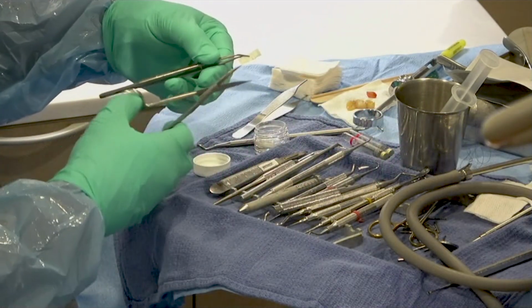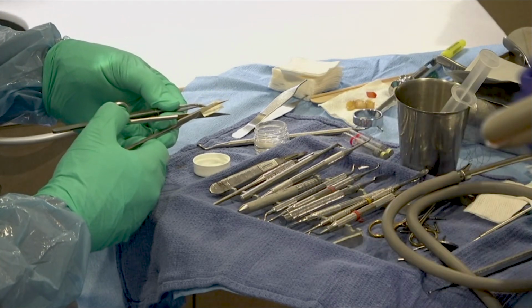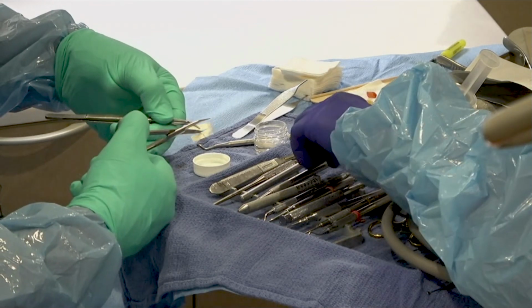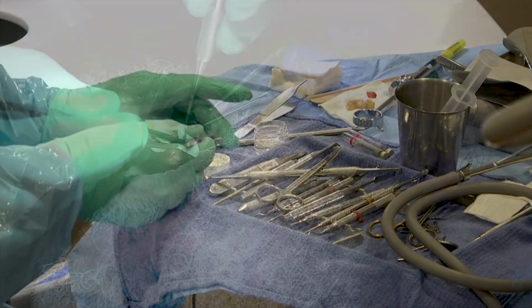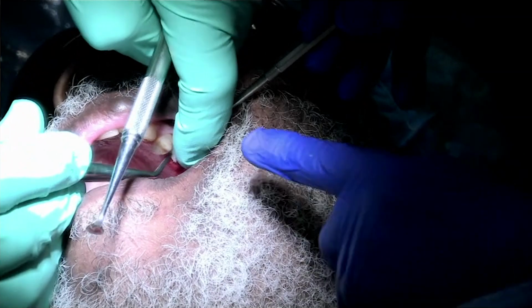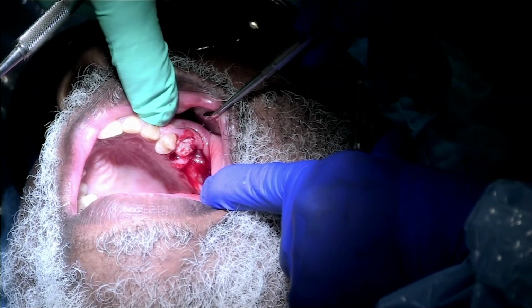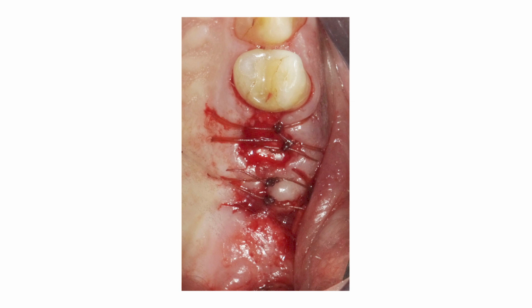So we want to trim this dry and then place it dry. And let it hydrate. Then we're going to tuck it underneath the palatal flap, like that. And then we'll suture it. So this is what the case looked like after sutured up. Here's the membrane tucked under the palatal and on the buccal.